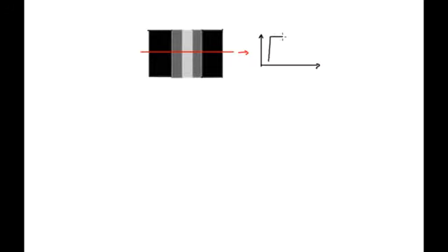So it starts out low and goes high. So the black regions are high dose in this cartoon. Then in the middle it's low, it comes back up and goes back down. So you'll see in the middle there's a low region of dose. That might be, for example, where you're trying to spare the cord in a head and neck treatment from the AP direction, let's say.